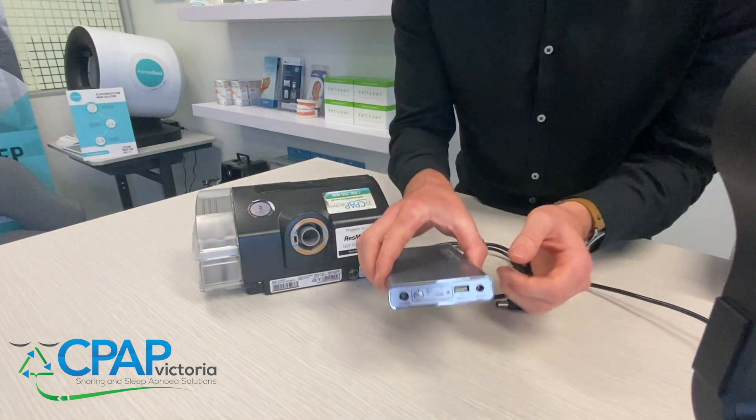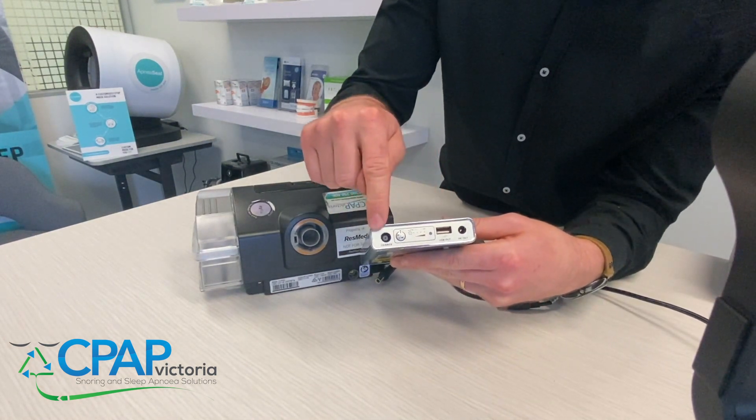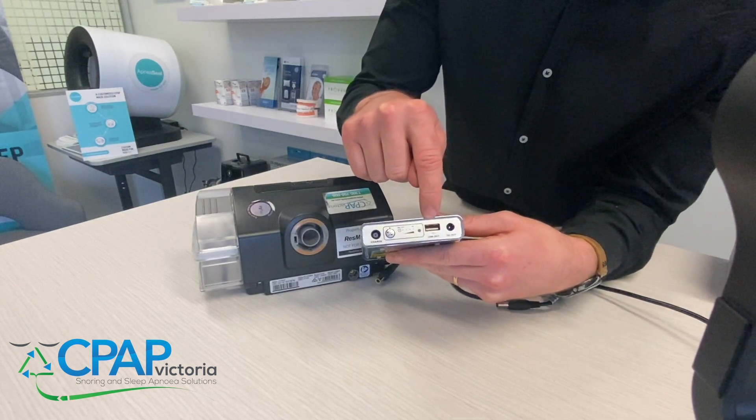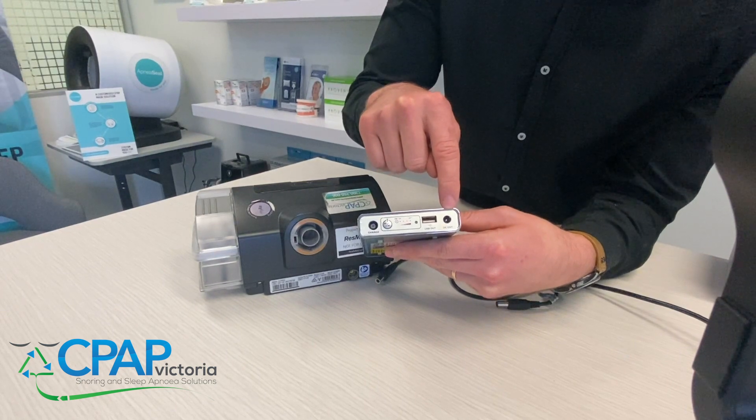I just want to illustrate a couple of things on your battery here. You've got a few different ports: you've got a charging port, a USB output port so you can charge your phone or anything with a USB, and then you've got your DC output port as well.